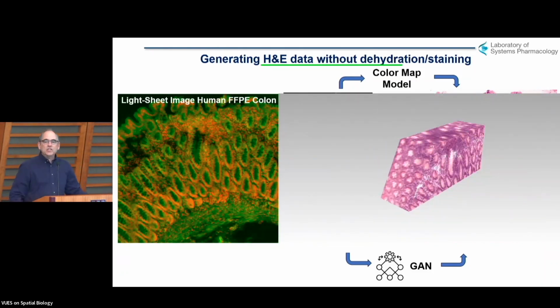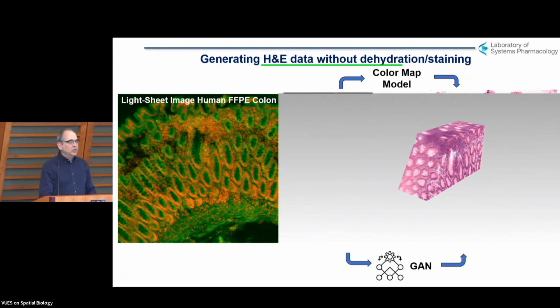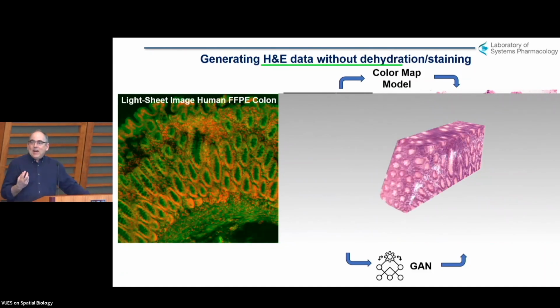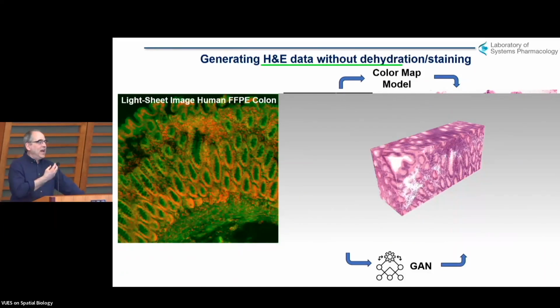And so I think the first 3D tissue data set of which you're going to see routinely is going to be this virtual H&E. And we're hoping to release a substantial amount of that data in the next year, because it's actually pretty simple to collect. The hard part is figuring out what it is. So if we can now take that three-dimensional data and we can now use either the foundation models plus classifiers and automatically label this. And we can then overlay some of the high dimensional data I've just shown you. We have the possibility, I think, for a really interesting near-term win.